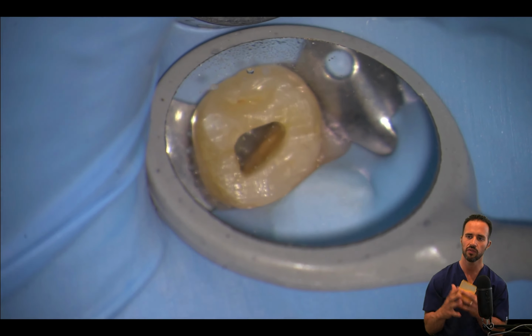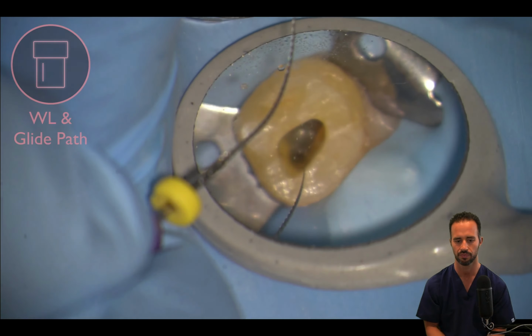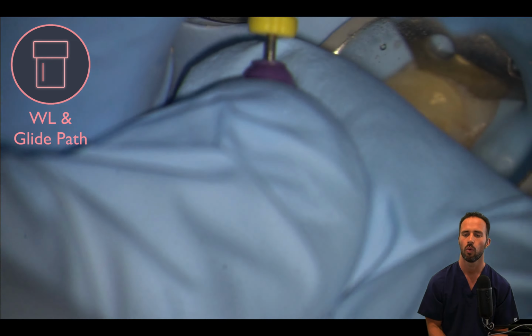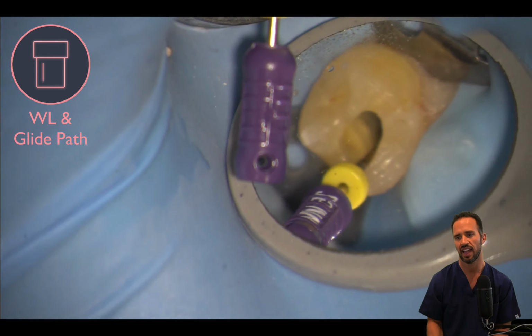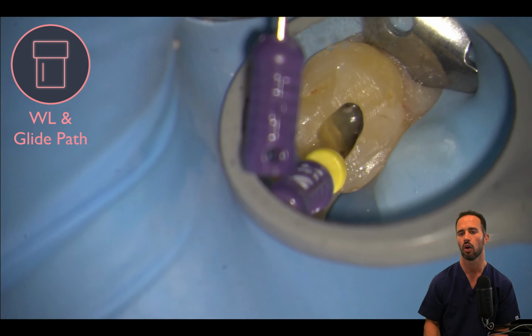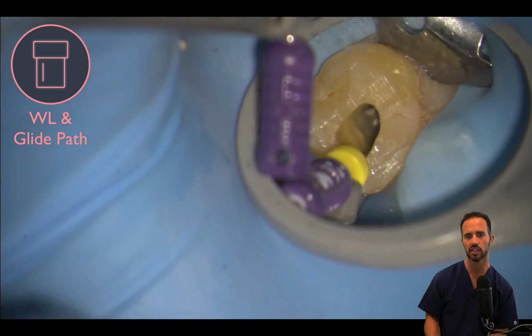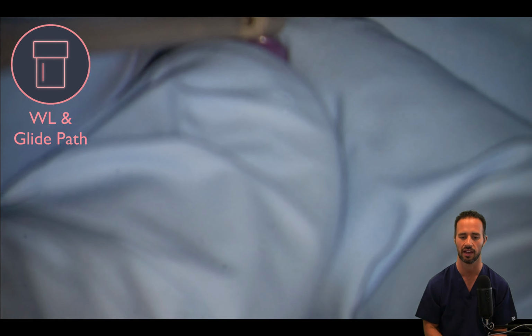Number one, once you've instrumented the case, you can better visualize and triangulate the location of the MB2. And also, you're able to fully disinfect the canals, and you can leave sodium hypochlorite soaking in the main canals while you look for your MB2. This way there's more time for the sodium hypochlorite to do its disinfection action, right?